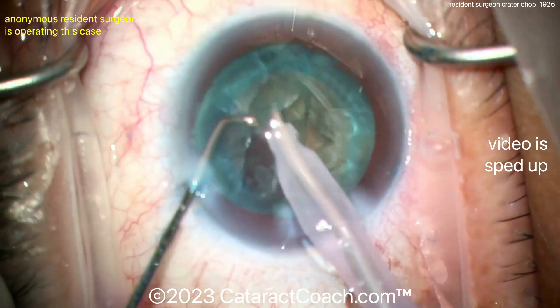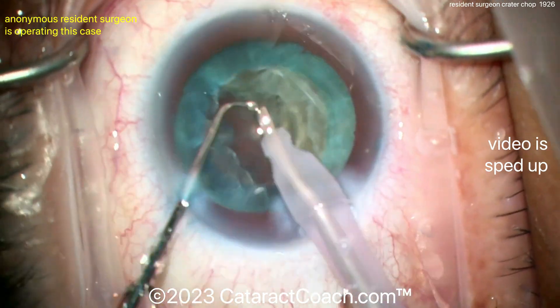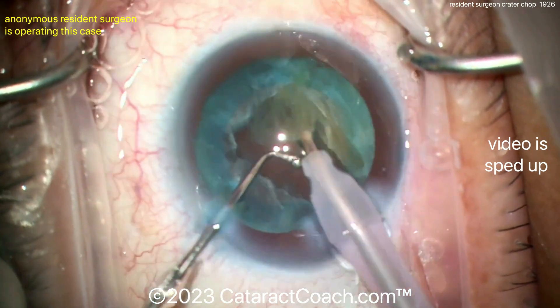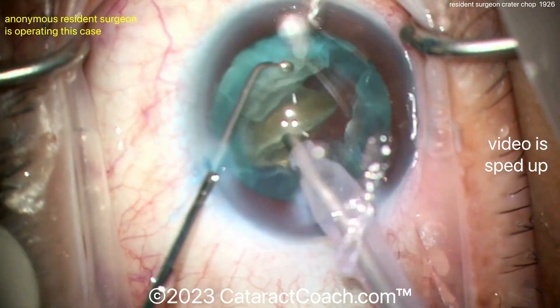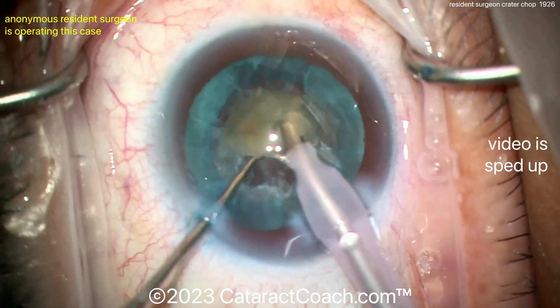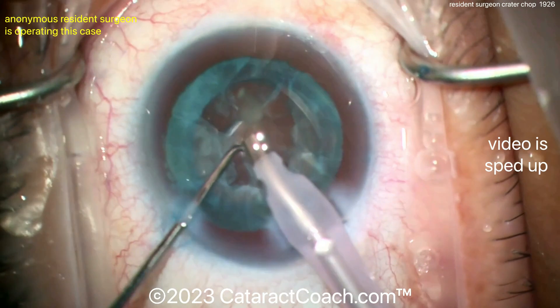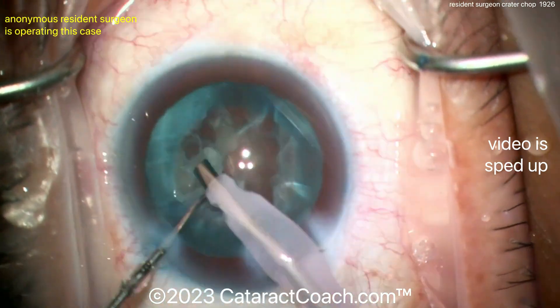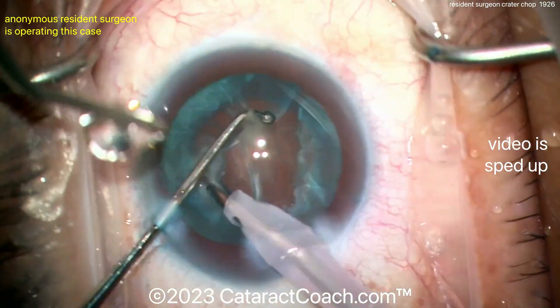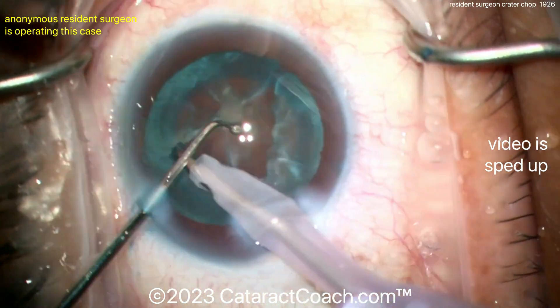With traditional phaco chop or horizontal chop, you have a time constraint — you buzz in with the phaco probe and you've got maybe a second or two to accomplish the chop before the probe loses its holding power. But with crater chop, you've dug that central crater; all you have to do is put the probe in for counterforce, then put the chopper around the lens equator and achieve that horizontal chop pretty easily.